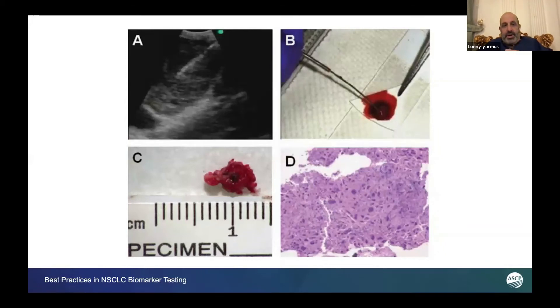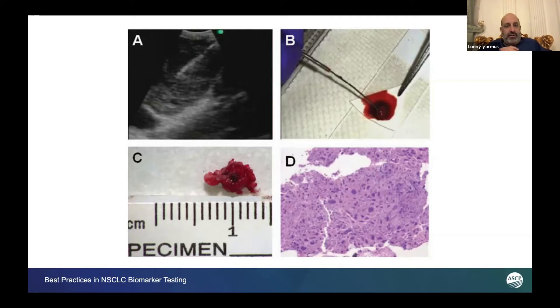And this is how we do it. Panel A is station seven lymph node. You can see that white line there — that's the needle under ultrasound going directly into the lymph node. So we know definitively that we're in there.